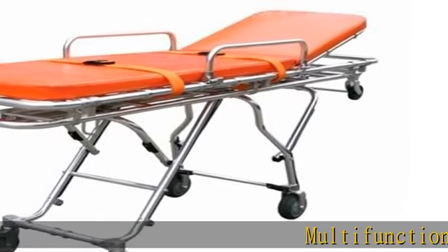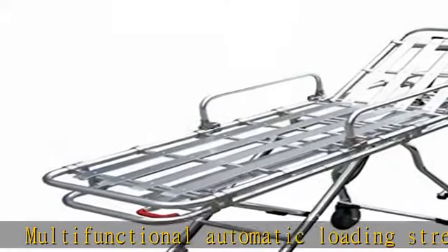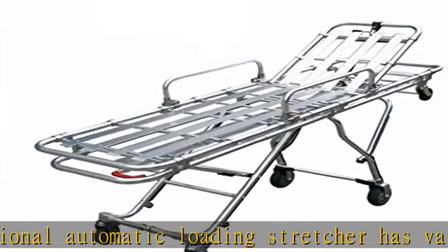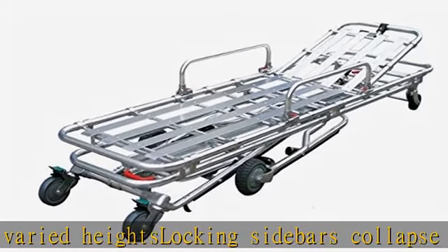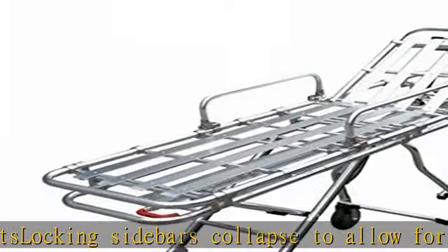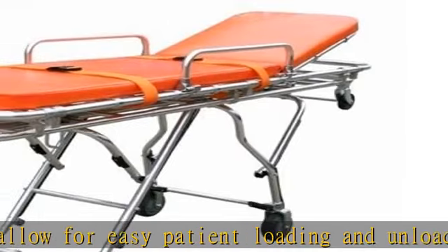Multifunctional automatic loading stretcher has varied heights. Locking sidebars collapse to allow for easy patient loading and unloading. Safety belt included. Aluminum alloy automatic loading folding hospital gurney is made of high strength aluminum alloy thick wall pipes. Incremental heights: 23 inches, 30 inches, 34 inches, 37 inches.